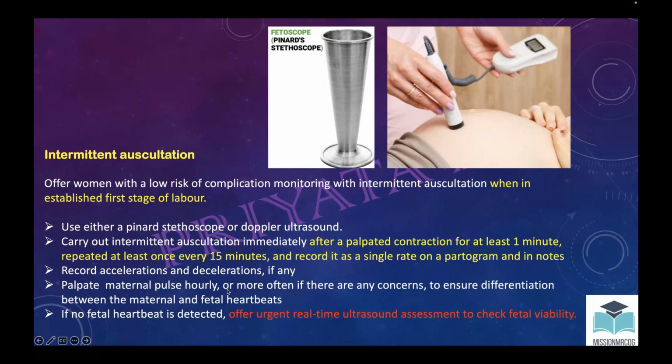And another issue that can happen, which is very common, is whether you are hearing the maternal pulse or the fetal pulse. So you have to differentiate it. And maternal pulse has to be checked hourly.